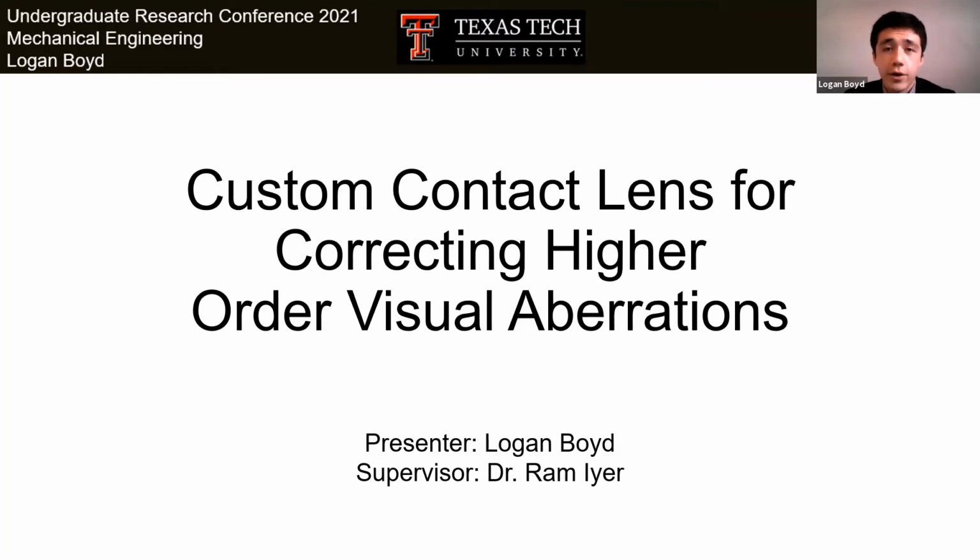I am a senior in mechanical engineering, and I've spent the last couple semesters working with Dr. Ram Iyer in the mathematics department to design custom contact lenses to correct higher order visual aberrations with the MATLAB program.